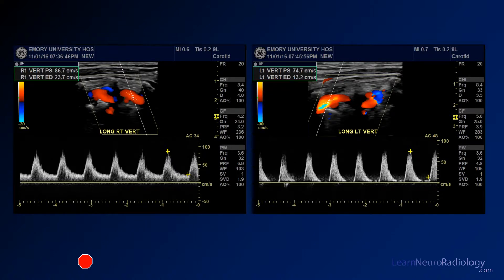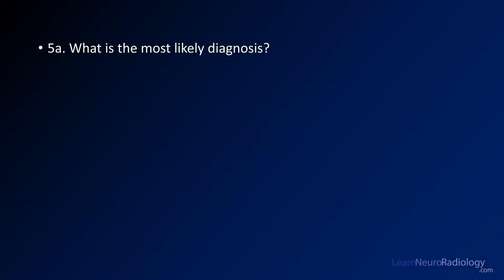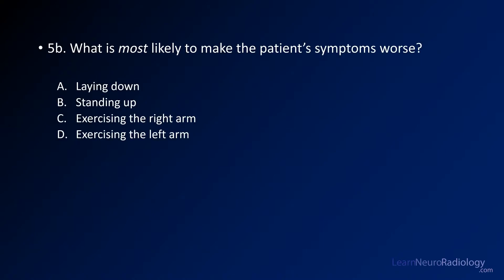It's a little bit unusual in neuroradiology to have ultrasound, but I do have an ultrasound for you. This is an ultrasound of the neck. So what is the most likely diagnosis, and what is most likely to make the patient's symptoms worse?